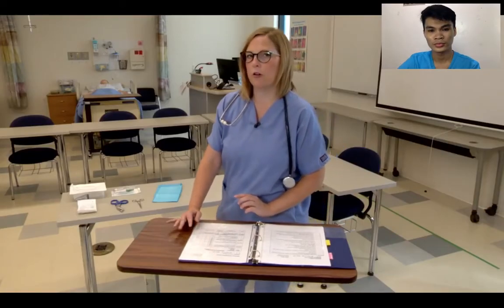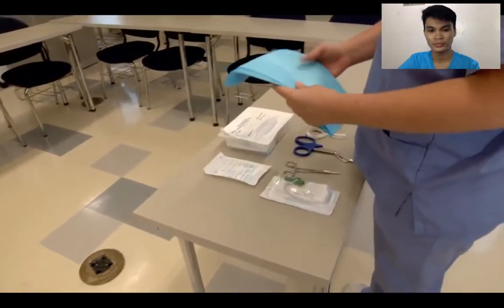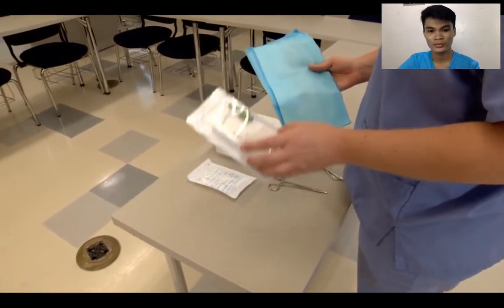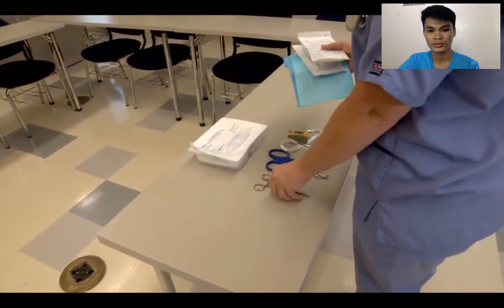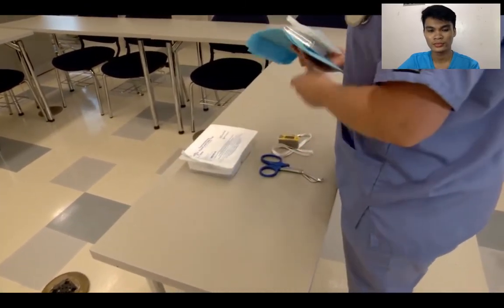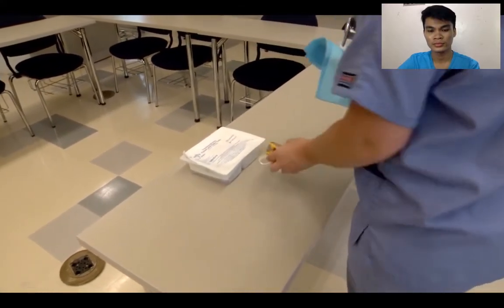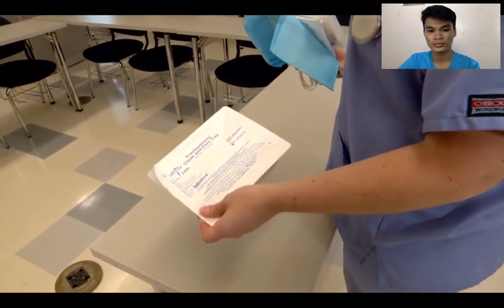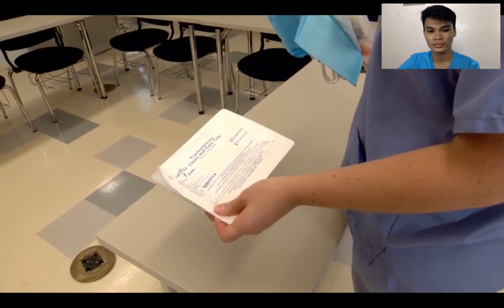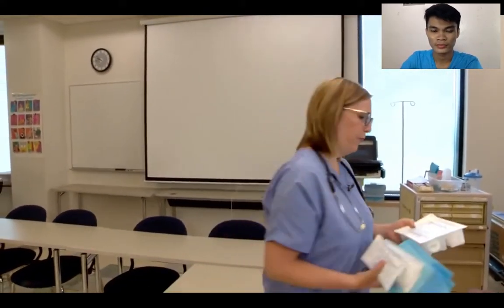Now we're going to go gather our supplies. We'll need a drape, suction catheter, extra pair of sterile gloves, hemostat, bandage scissors, pulse oximeter, and our trach care kit, which will have our cleaning solution, trach ties, and gauze. Now I'm going to go enter the patient's room.